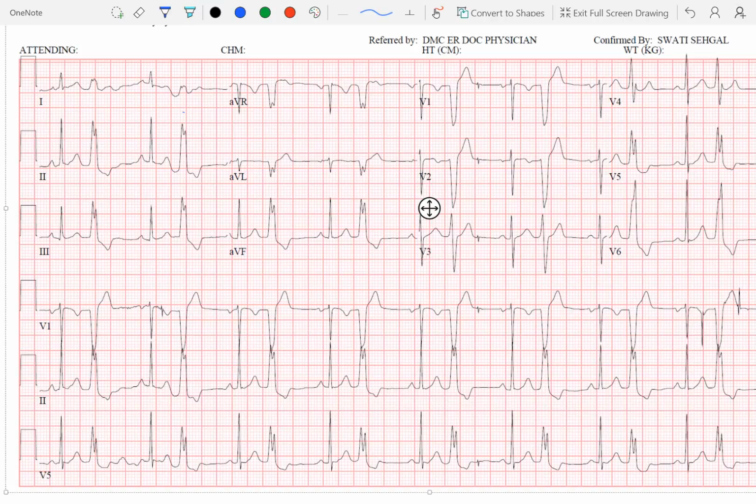You can look at this and say, well, on lead V1 I have a left bundle branch like morphology, suggesting that I'm activating the right ventricle first. Okay. Because V1 is a precordial lead, and it's an anterior lead, and it's a rightward lead as well. So any PVC coming from the right ventricle would be going away from that lead and would produce a left bundle branch block morphology. Right. Any PVC that is coming distinctly from the left ventricular free wall is going to go towards lead V1, and it's going to make a positive or right bundle branch like QRS on that lead.